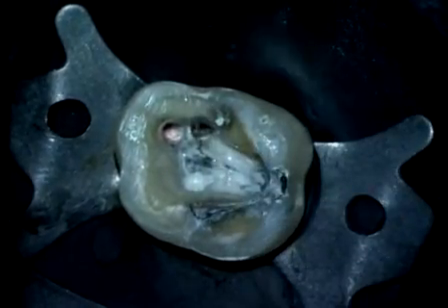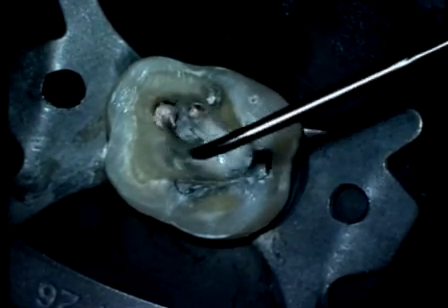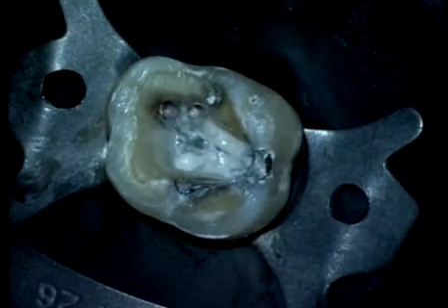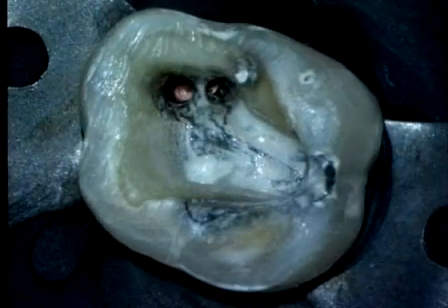The process continues. The touch and heat is activated and is allowed to plunge another 3 to 4 millimeters into the gutta percha mass. A bite is effectively removed, and this allows for another wave of condensation. Step the plugger around the canal. A sustained press moves gutta percha into all aspects of the root canal space.